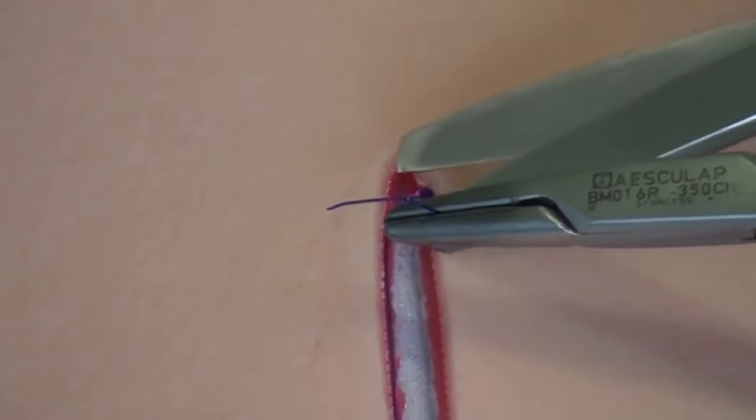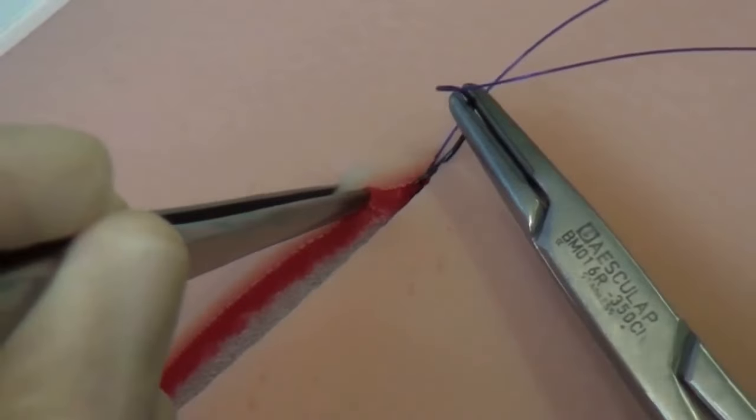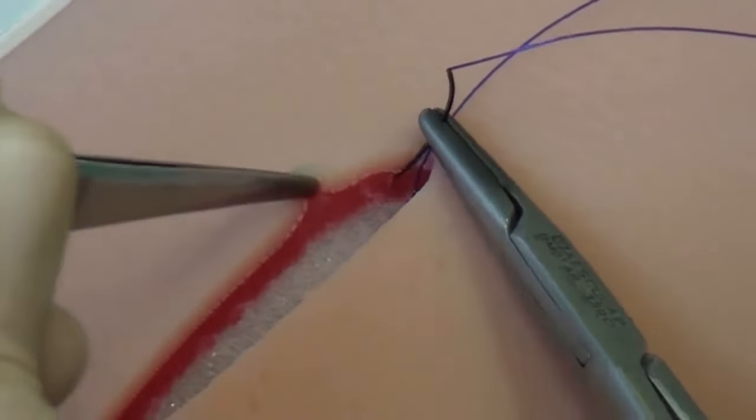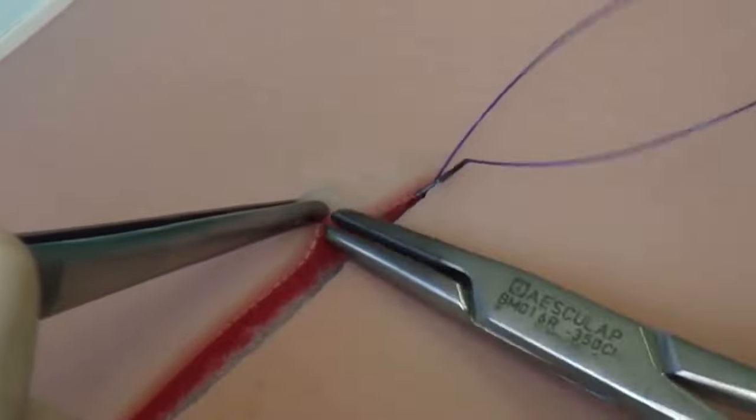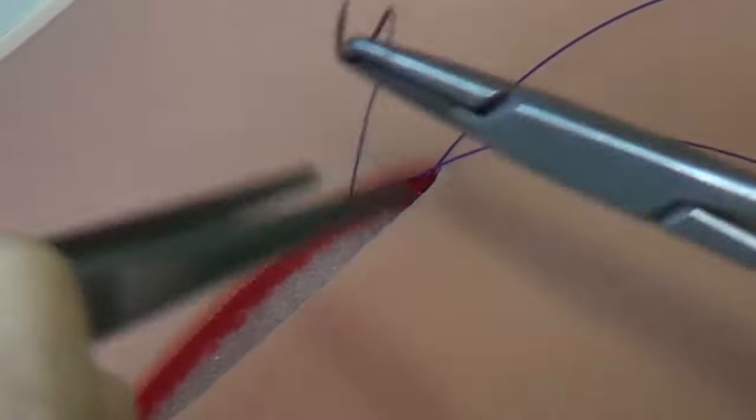The end of the thread is cut. If you are right-handed, you sew from right to left. When sewing, the right hand holds the needle holder with the needle, and the left hand holds the tweezers.